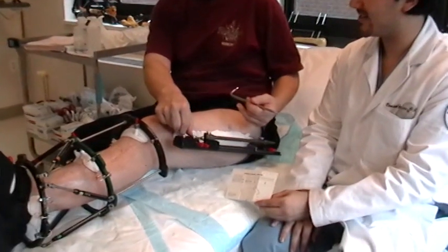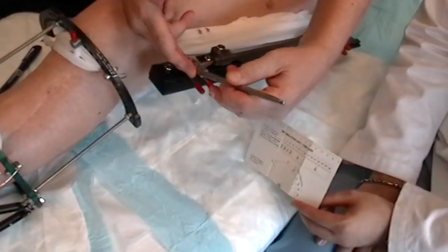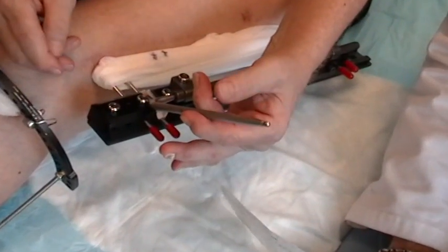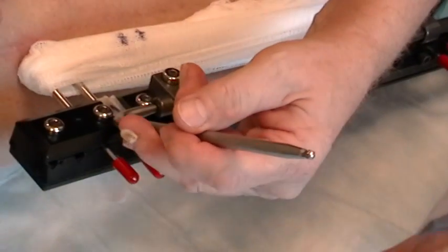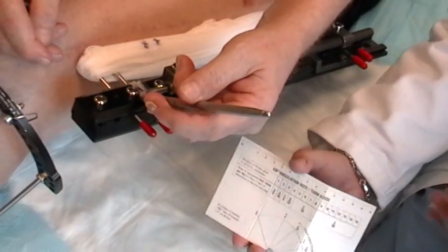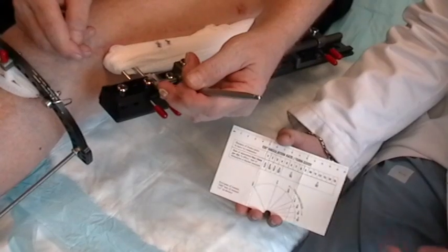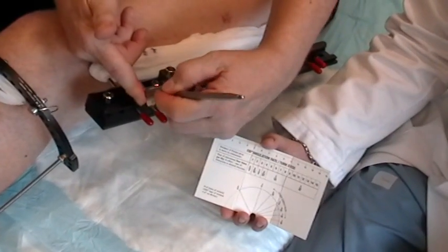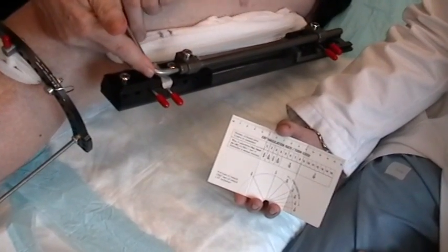It's probably important that you have a little arrow here so you don't forget. Kevin has the Allen wrench, also known as the L wrench, and once he puts it in, he automatically knows where to start. There are different ways to do quarter turns — a 90-degree right angle, 12 o'clock to 3 o'clock, or whatever is easiest for the patient to do. Kevin's a pro at this now. Once I get it in, I can see where I go for the quarter turn and I approximate that to be a quarter turn.